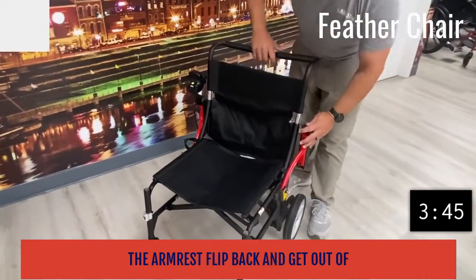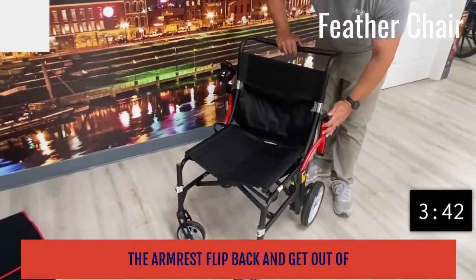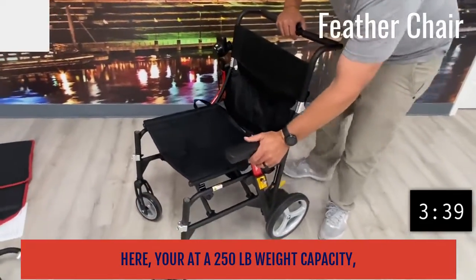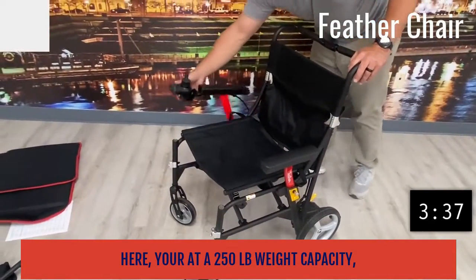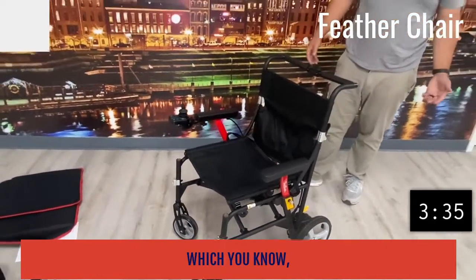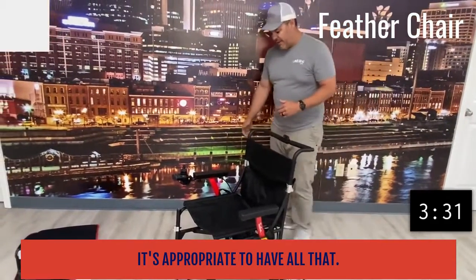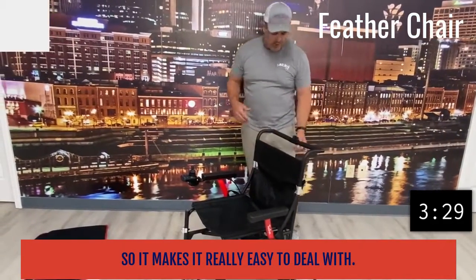The armrests flip back and get out of the way, which is a nice little feature. You're at a 250-pound weight capacity, which is going to handle a lot of people. I think with the seat width, it's appropriate to have that capacity, and it makes it really easy to deal with.